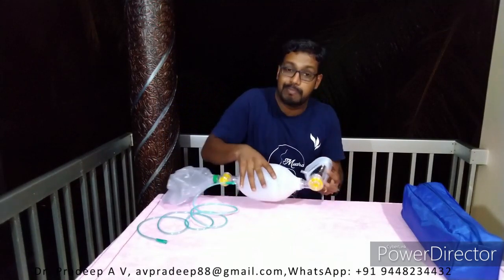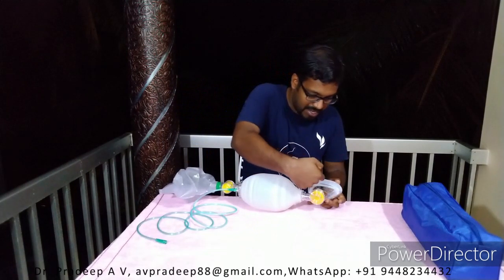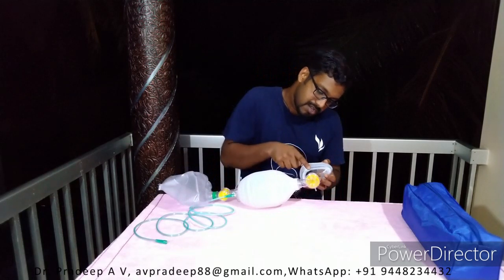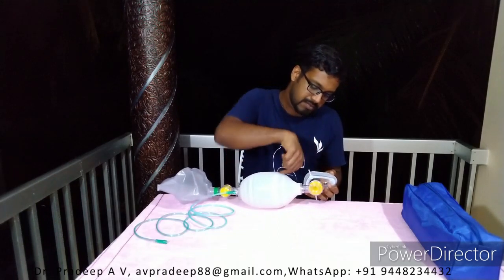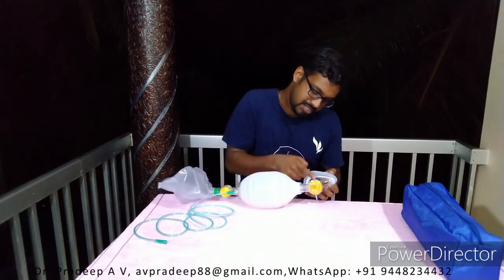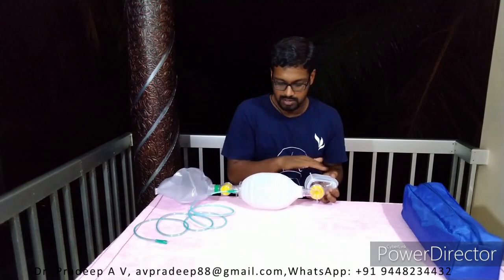So when you press, the air goes from here all the way in and goes into the lungs of the patient. So there will be excess pressure in the lungs, and when he exhales, the gas comes here, and there's another valve here that allows the gas to go out. So there won't be any backflow from here to the bag. Whatever gas comes from the lungs will go through this valve and comes out of here like this to the outside. So this is all about it.